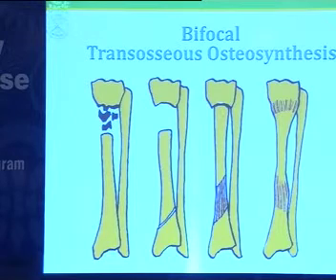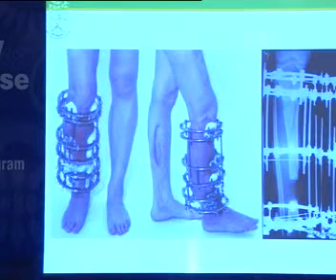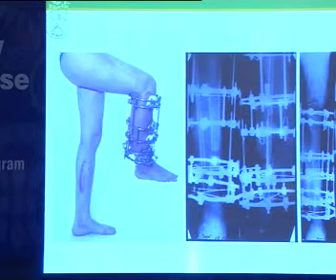The scheme of bifocal transosseous osteosynthesis. Patient's diagnosis: tibial pseudarthrosis, osteomyelitis. Sequestral necrectomy of tibial fragments, fixation using the Ilizarov apparatus. The defect was substituted with lengthening of the proximal fragment of the tibia. Short-term follow-up: no fistula, integrity of the bone was restored.